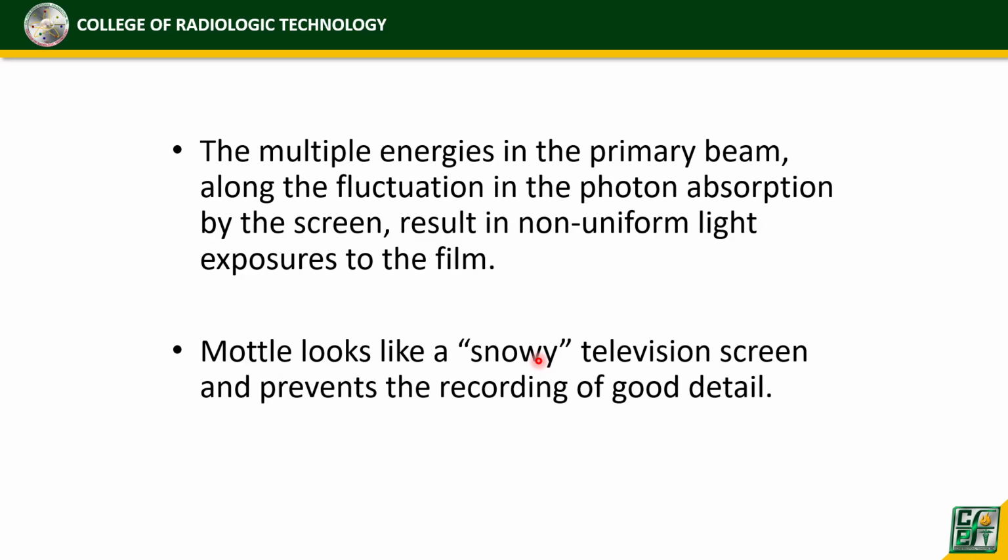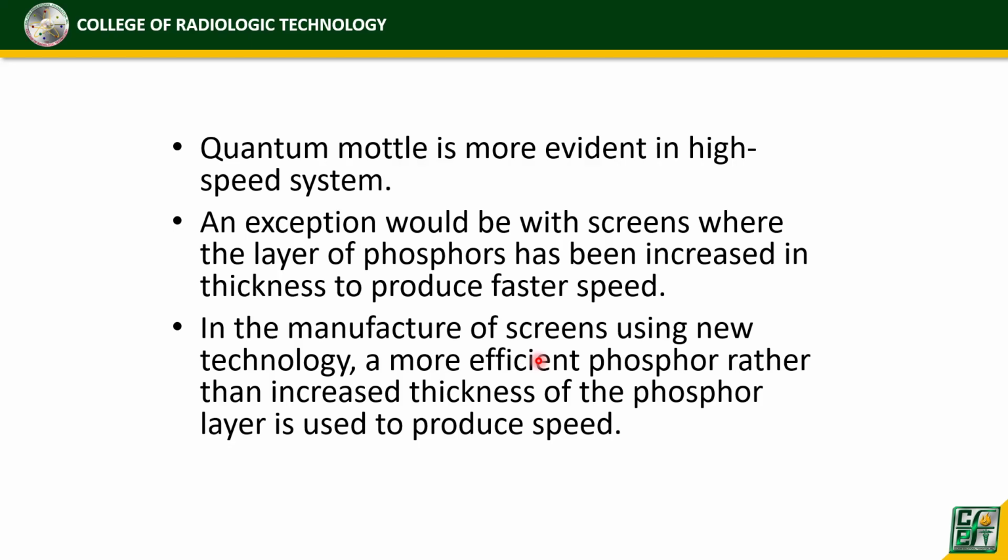Okay? So, sa radiography, mottle prevents the recording of a good detail. So quantum mottle is more evident in high-speed screen. An exception would be screens where the layer of phosphor has been increased in the thickness to produce faster speed. So the manufacturers screen using new technology. So ayan. So nakadepende sa thickness ng phosphor layer. Okay.